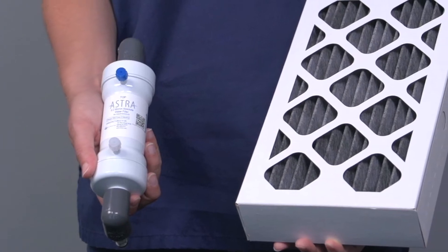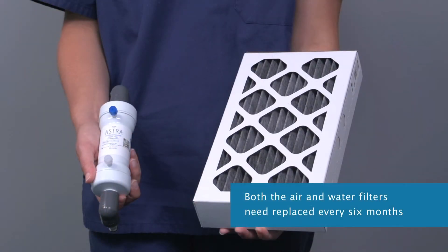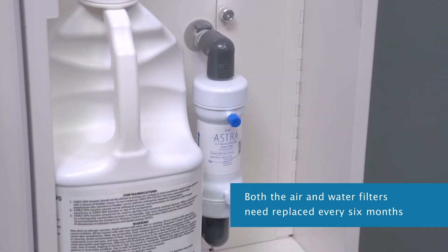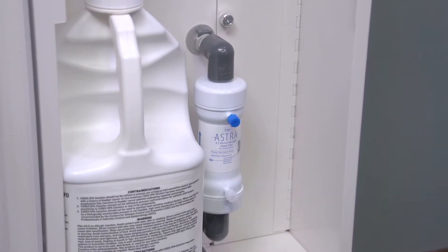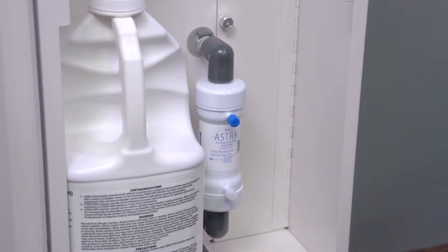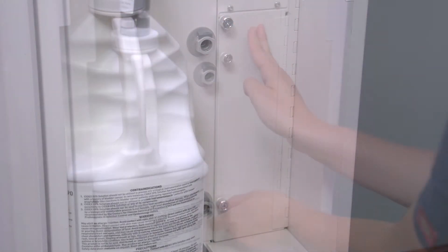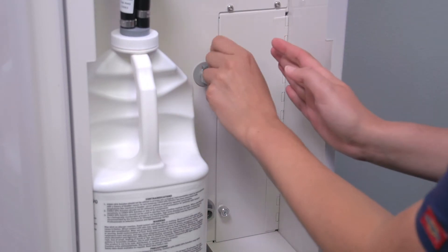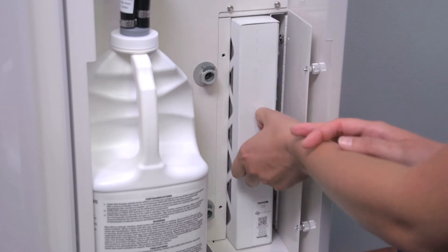Every six months you will have to change the water filter and the air filter. The Astra comes with a 0.2 micro bacterial retention water filter that ensures your probe is rinsed with properly filtered water. How long the water filter lasts will depend on your water quality and the number of procedures you do. The carbon filter and fan inside the Astra trap fumes so that HLD vapors are filtered and vented on the lower right side of the device.